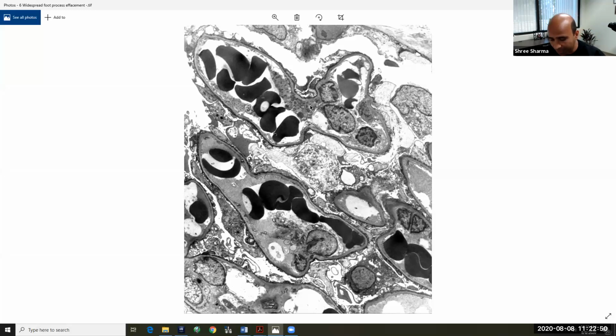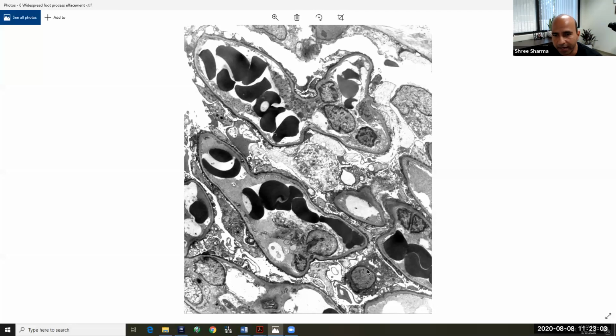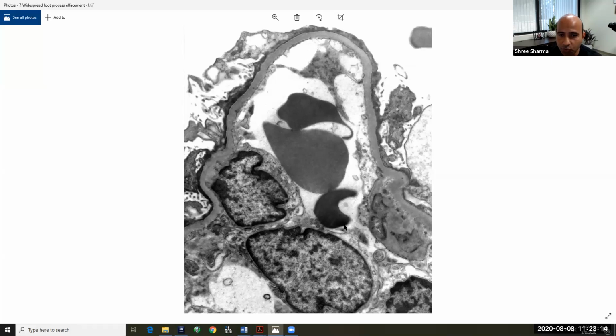We are damaging the podocytes. That's why this is a podocytopathy. FSGS is a podocytopathy. In your board exams, most of the time, you get a simplified image. If you end up getting a bigger image, you will be confused. Where should I look? Hey man, what are these nuclei? What is that cell? So to simplify life, most of the time in exams, you end up getting a very simple image. So basically the pathologist is asking you to focus right here, okay?